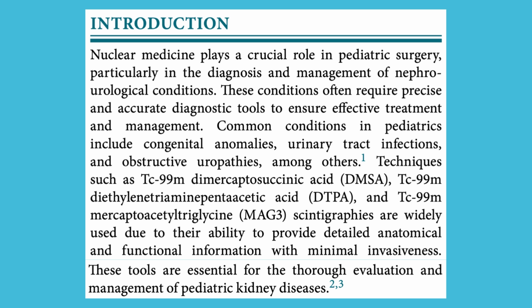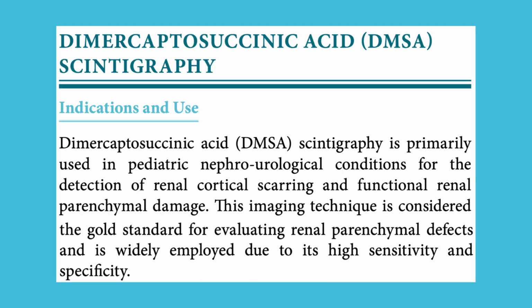Techniques such as TC99M dimercaptosuccinic acid, DMSA, TC99M diethylenetriamine pentacetic acid, DTPA, and TC99M mercaptoacetyl-triglycine, MAG3 scintigraphies are widely used due to their ability to provide detailed anatomical and functional information with minimal invasiveness. These tools are essential for the thorough evaluation and management of pediatric kidney diseases.